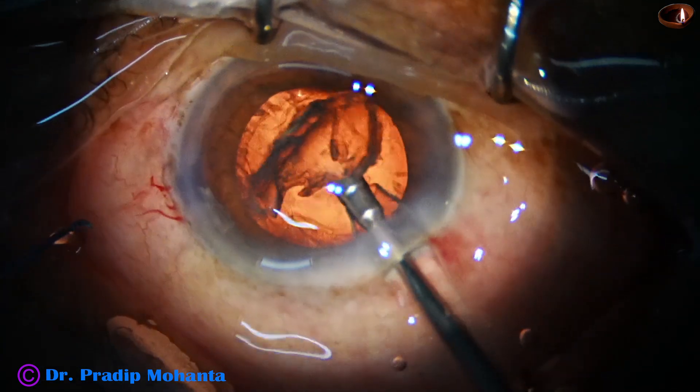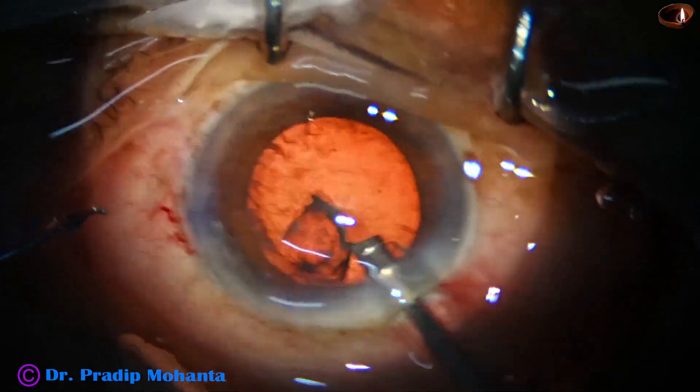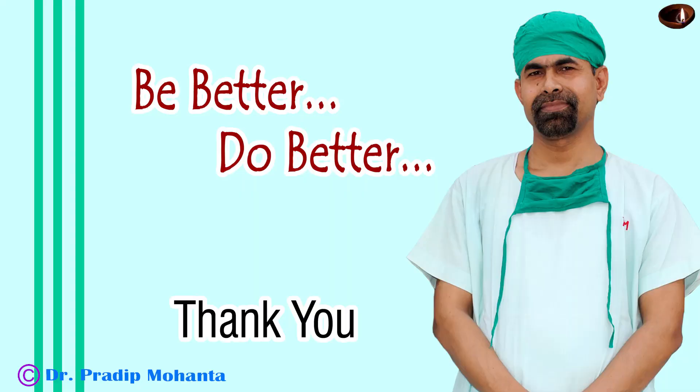Now after injecting some viscoelastic, the epinucleus is cleaned. Thank you very much for your attention.